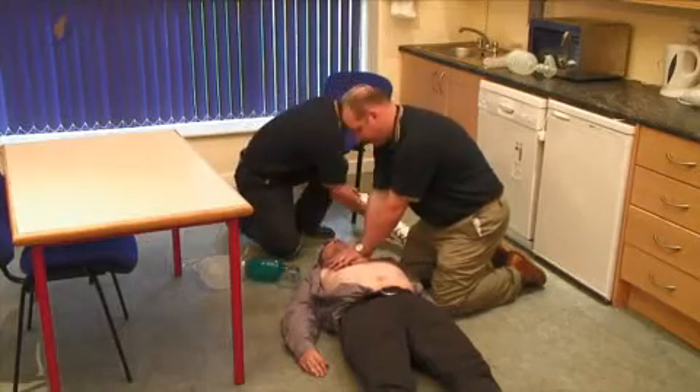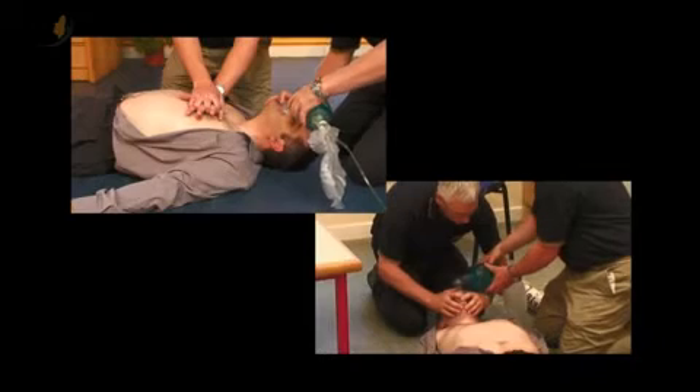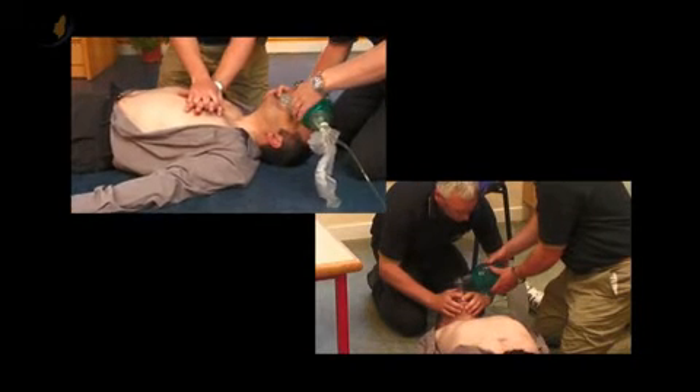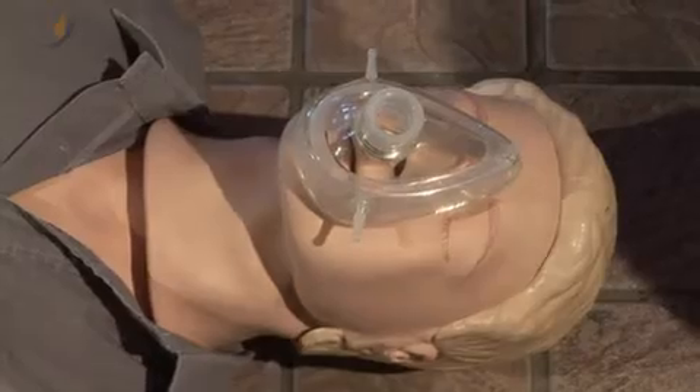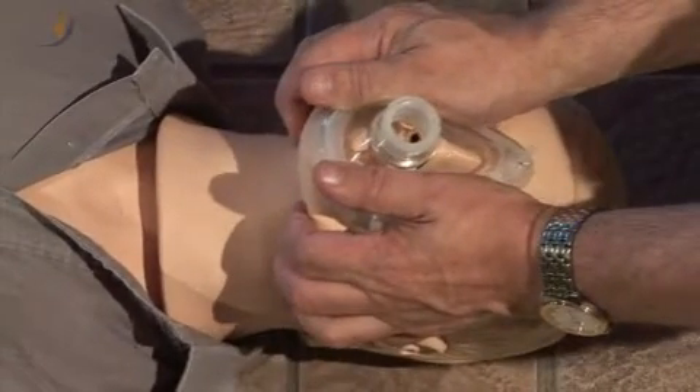For practitioners, the Pre-Hospital Emergency Care Council recommends that one or two persons may be used to ventilate a patient using a bag valve mask. The most important thing is to ensure that an adequate seal is achieved.